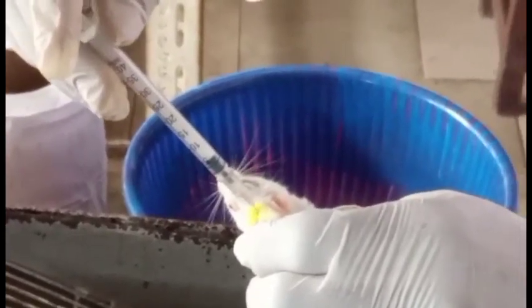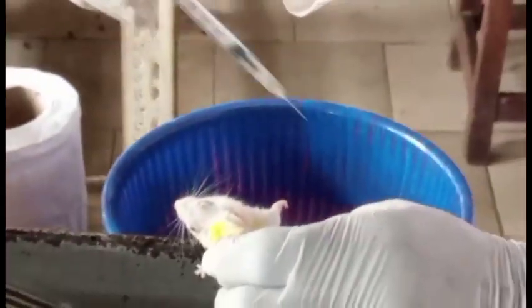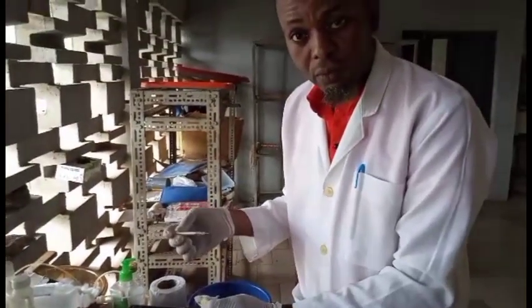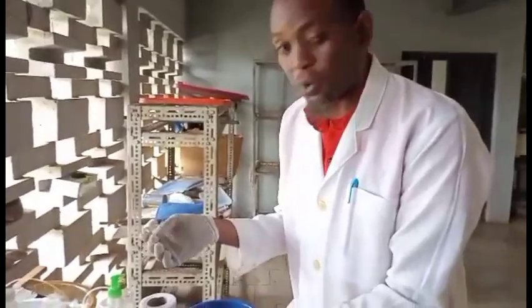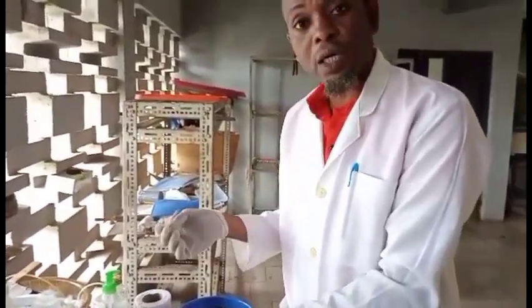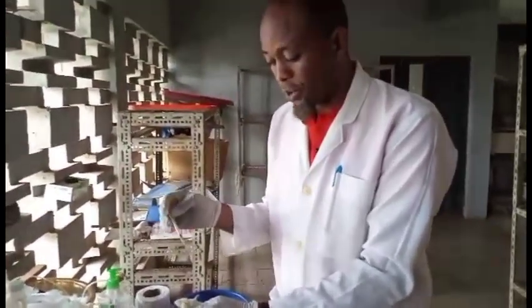Now you can see why it's sometimes good to place your hand on a support: once the animal is struggling, it will not injure the animal, because your hand is more stable now that it's on the platform. So that is one other technique, another method you can use when you are administering subcutaneous injection.